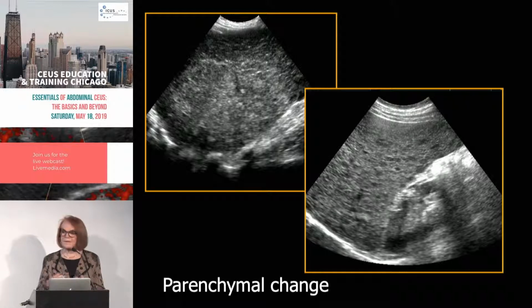And so what are the things that make a nodule suspicious? Well, in that liver, it would be a nodule that's bigger than those ones. All those little ones in the background, if there's one that stands out because it's bigger. And then the next one is that these are hypoechoic nodules. If one of them is blacker, a blacker nodule that's bigger, then we'll scan.